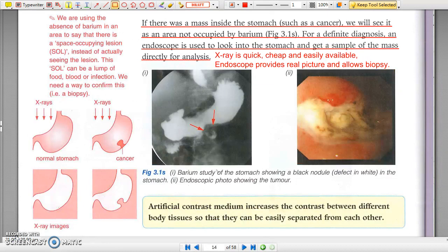With the artificial contrast medium, the attenuation of X-rays is greatly increased, and the target organs will appear white on the film as the transmitted intensity falls drastically. When abnormality is identified, endoscopic diagnosis such as biopsy often follows, so that the suspicious tissue may be sampled.